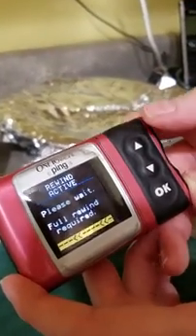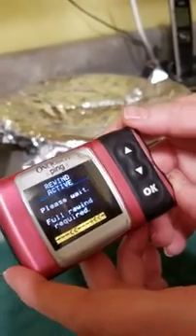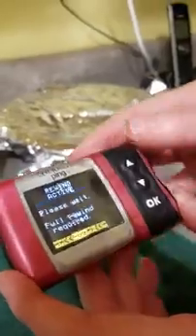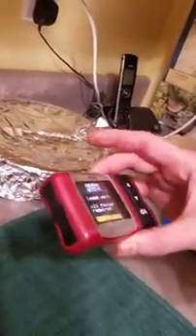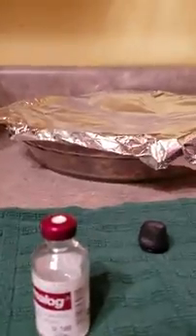And it reminds you to disconnect the pump from your body before you do all this. I don't know how I would do that with it connected. So it's never been a problem remembering to disconnect it from Michaela's body. So that needs a full rewind. So just going to let it do its thing.